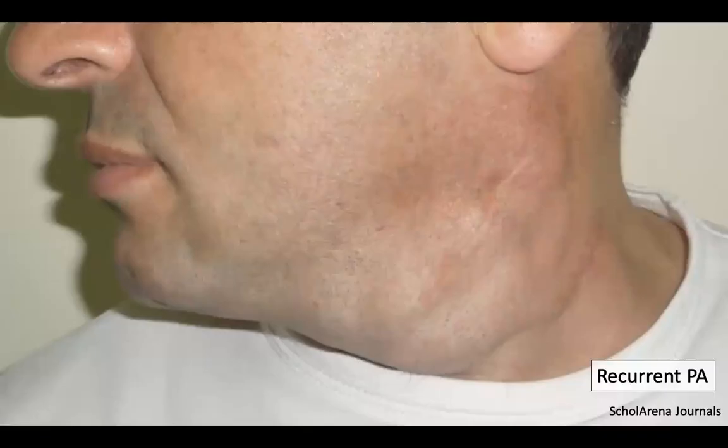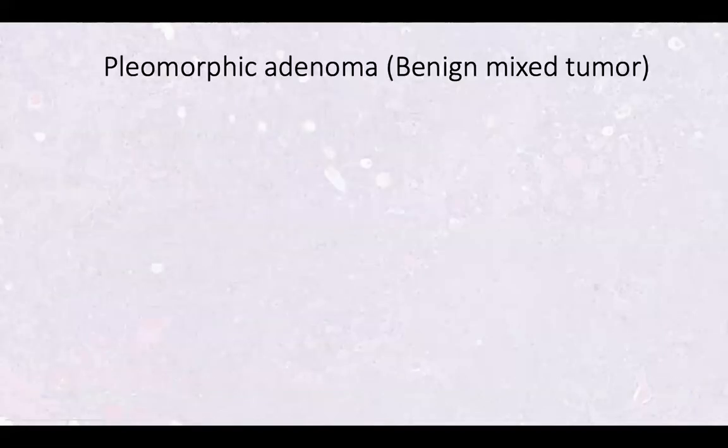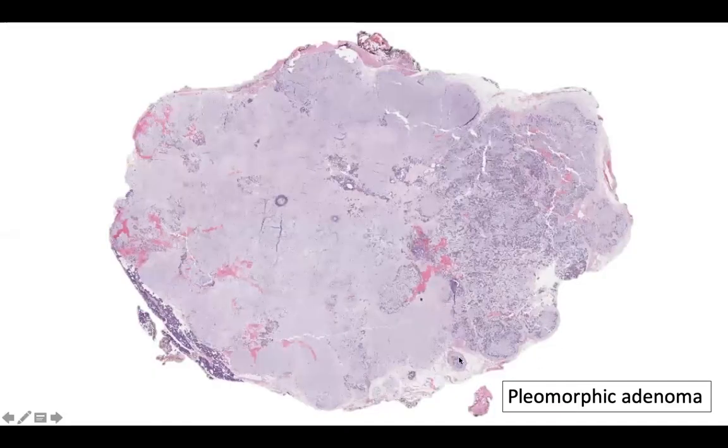I wonder if I have a good picture of a pseudopod. I probably should have one here. Let me see. So this is actually sort of a pseudopod. I probably should get some better images, but you see these little things sticking off the tumor, and that's really common. So sometimes these things will be left in the patient, and so yeah, margins can be a real mess in these.